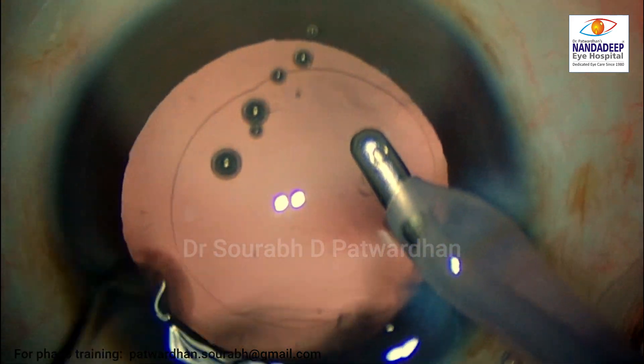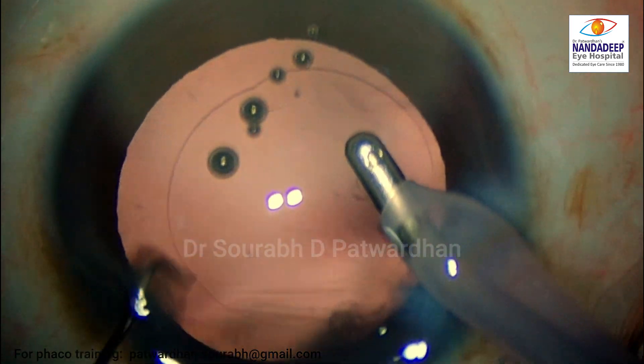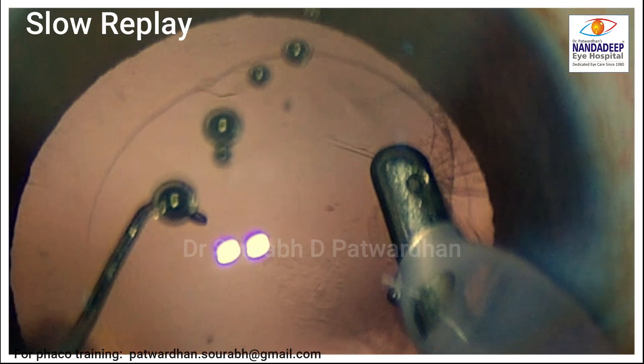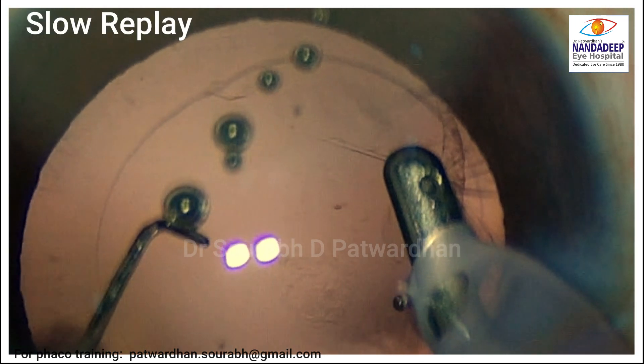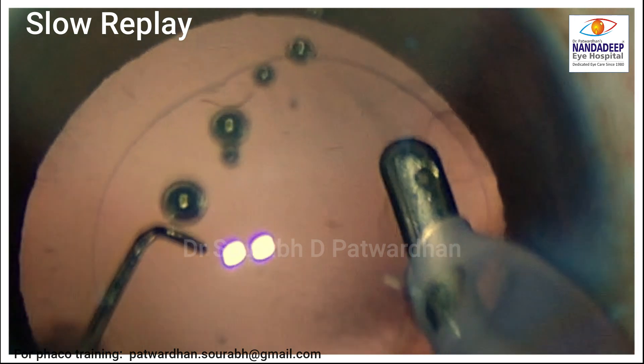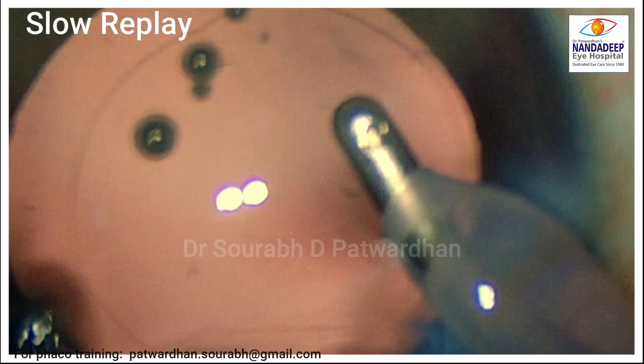The moment I hit the reflux, you will find that the posterior capsule is released from the IA probe and it is not damaged. See how it happens — when I press the reflux button, the fluid comes out of the aspiration port, releasing the posterior capsule.